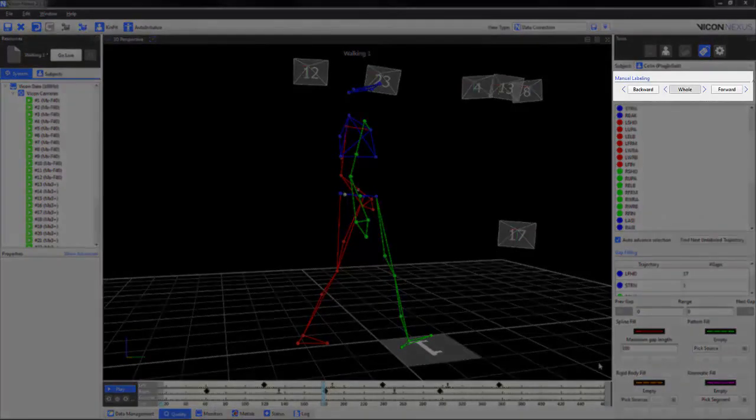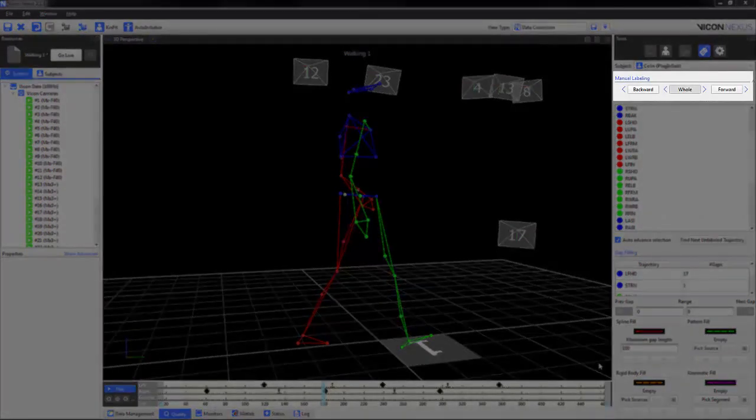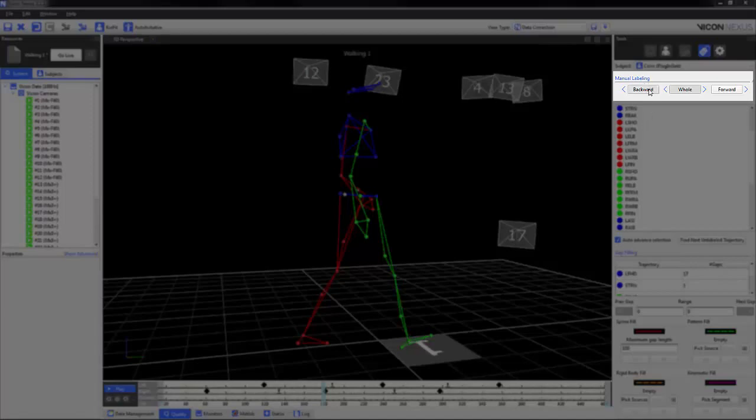Under the manual labeling option, you can choose whether the label is applied backwards, forwards, or to the whole trial.